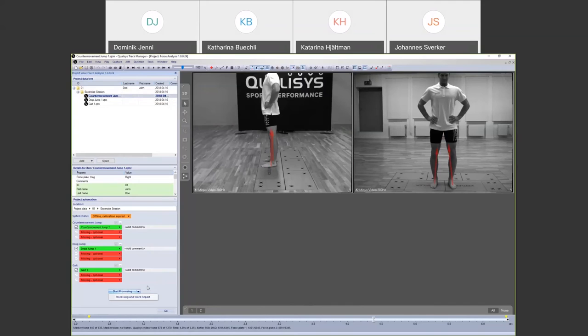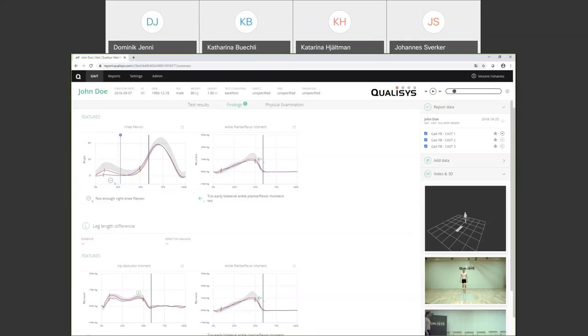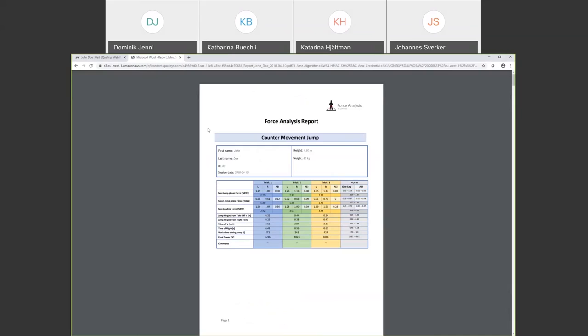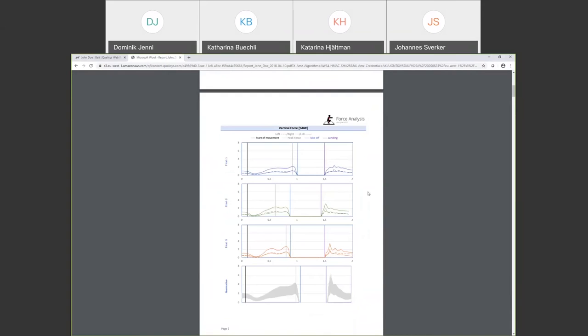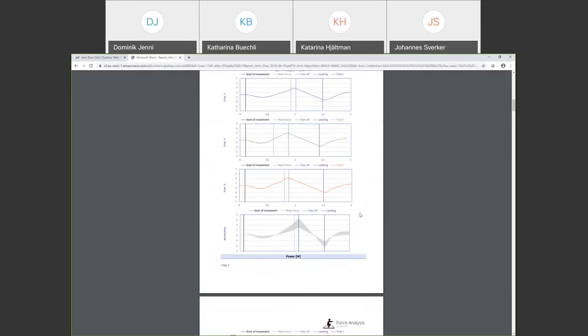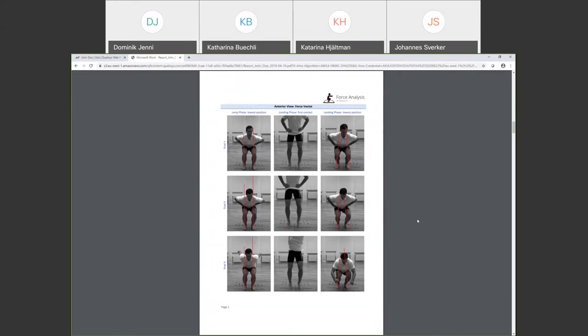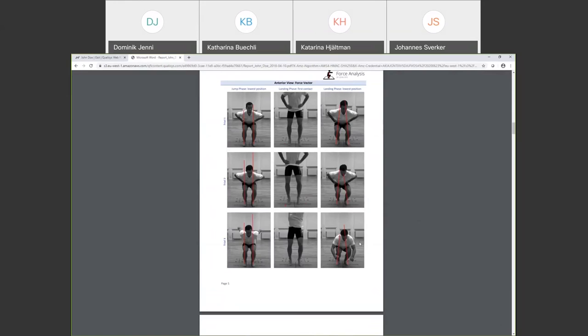The measurements can be presented in a Word report. The Word report is simpler than the web report but still includes useful information about the different measurements — a report for the countermovement jump, graphs of forces, velocities, and automatically captured images at certain points of interest, which are calculated from the force data.